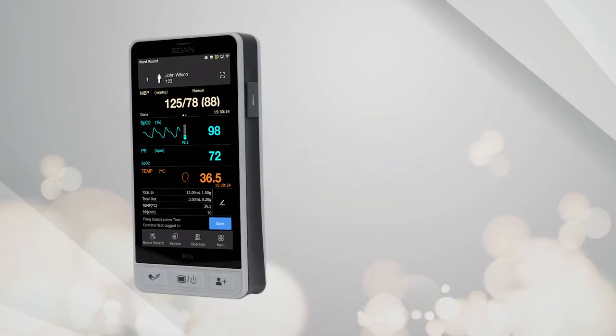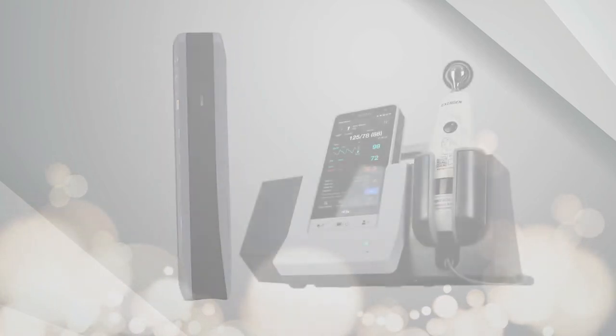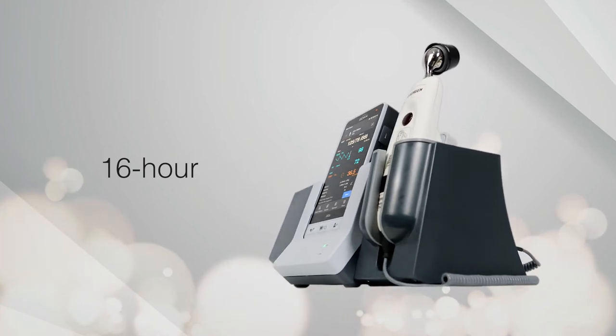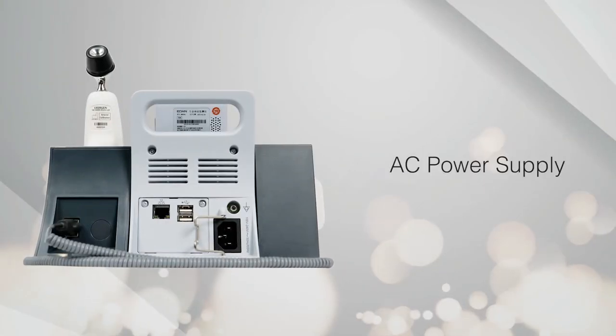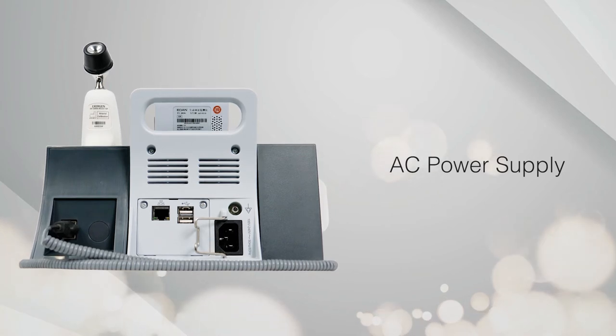A built-in lithium battery enables the IM3S to support 8 hours of daily runs, which could be extended to 16 hours if upgrading to the CS05 charger stand. AC power supply is also provided on the stand, so you can charge the device during standby.